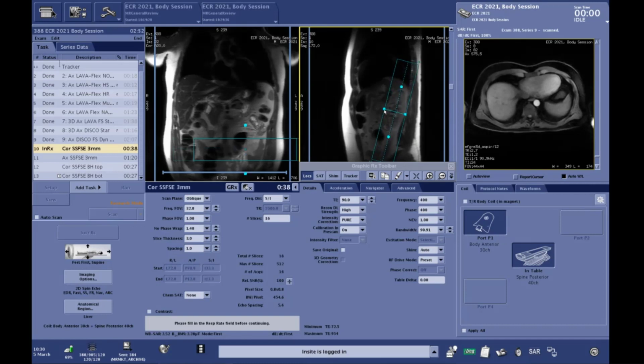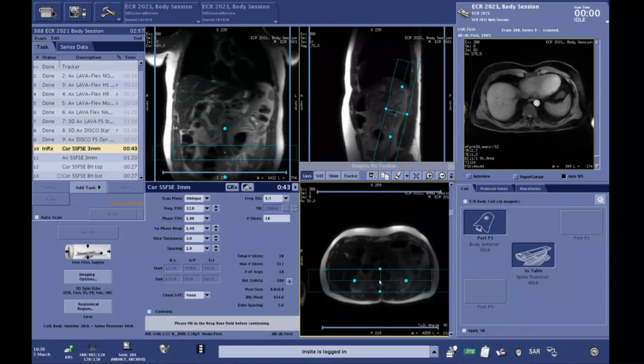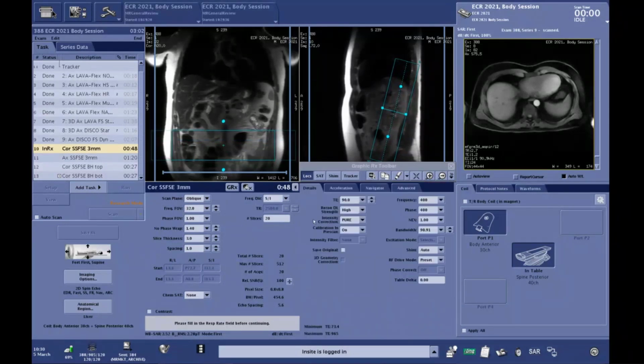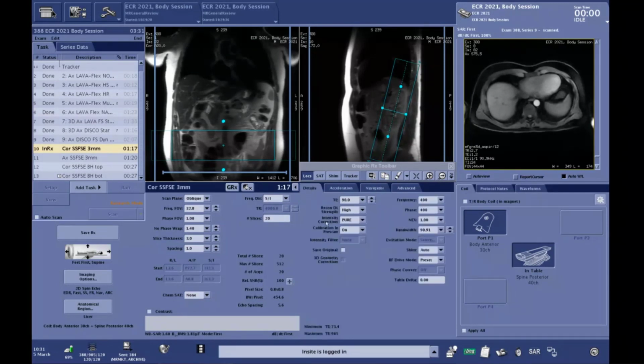We really want here to look really closely at the kidney morphology and structure. And you can see that we are using ERICON-DL here, which is our deep learning based reconstruction algorithm, which is working specifically on the raw data and which will remove noise and Gibbs artifact to deliver more SNR and sharper images.